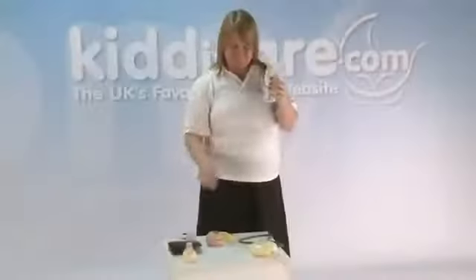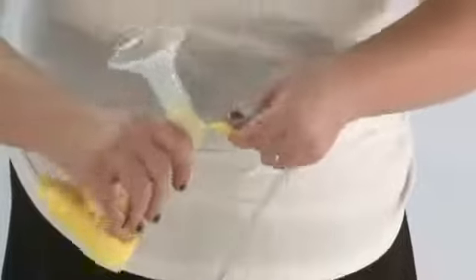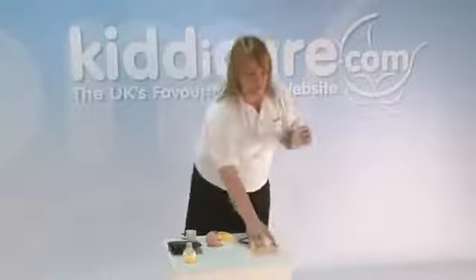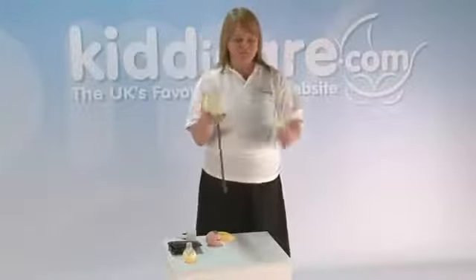So line that up and screw that on. And then your tubing from the back motor unit goes into the top hole here. Nice firm push, because obviously the breast pump works on good seals and vacuums, so make sure that it's a nice firm fit. And that's the unit back together.